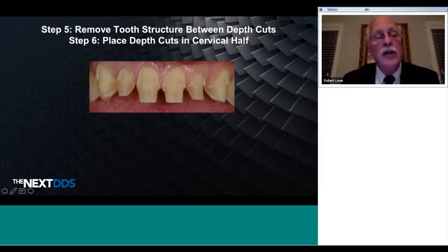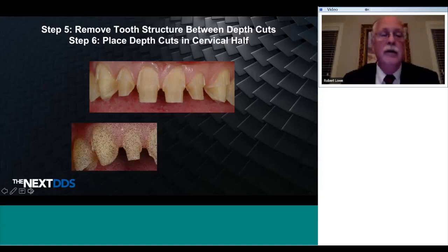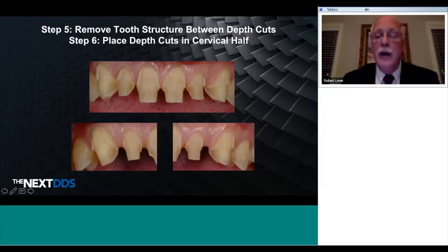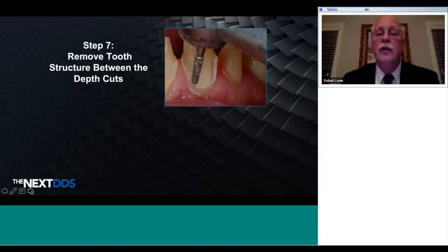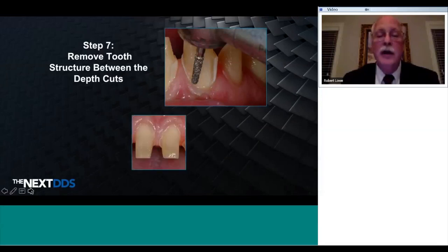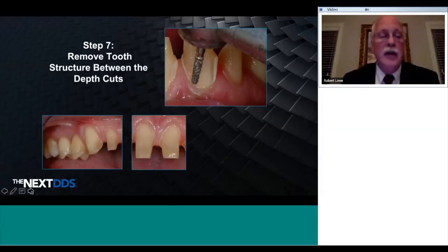Now I change the direction of the burr and make a depth cut there and reduce the second plane. You can see that happening. Depth cuts down here. Remove the tooth structure between the depth cuts. And now you have two planes of reduction. You can see 1, 2, 1, 2, 1, 2.